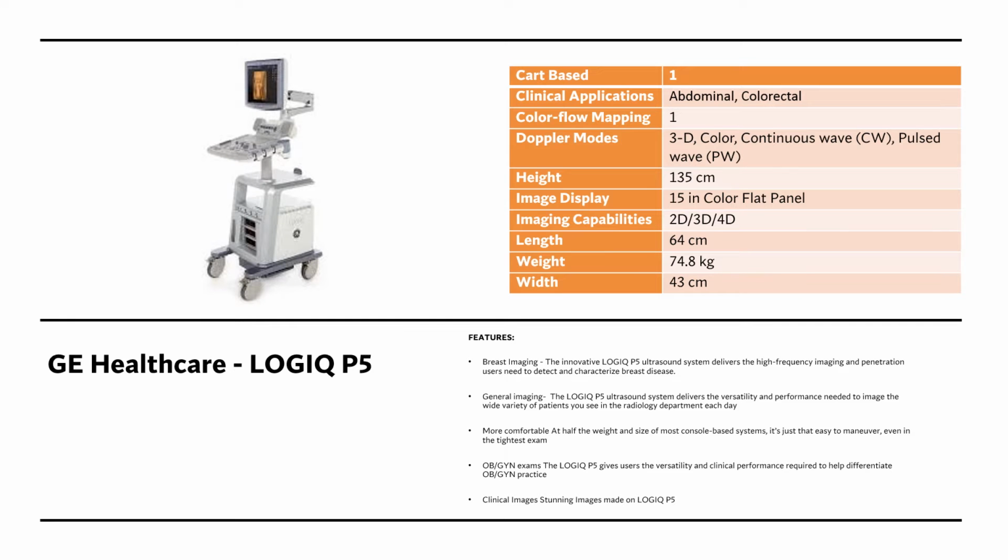The second candidate device is GE Healthcare Logiq P5. In specification, it is cart-based, with clinical application used in abdominal and colorectal. Doppler mode, it has 3D color, continuous wave, pulse wave. The weight is 74 kilograms.